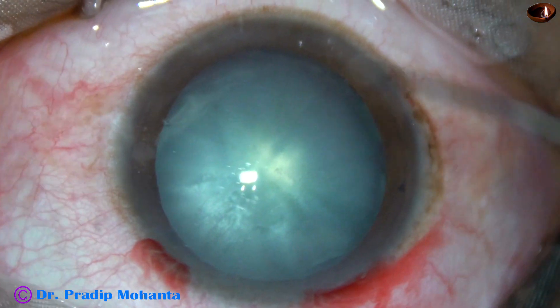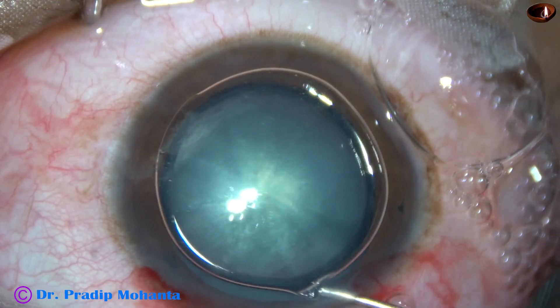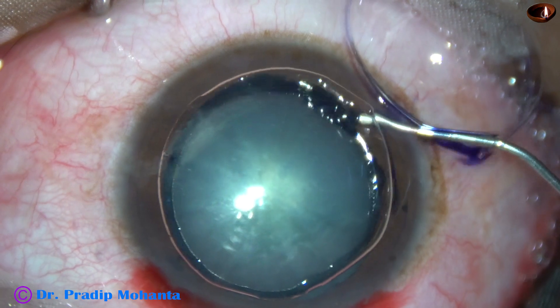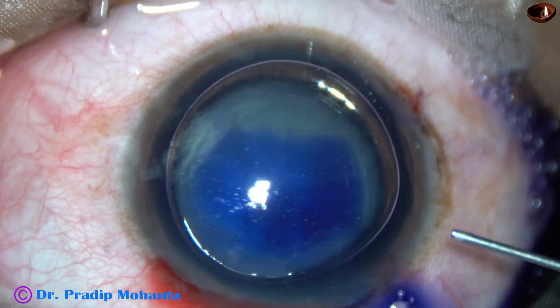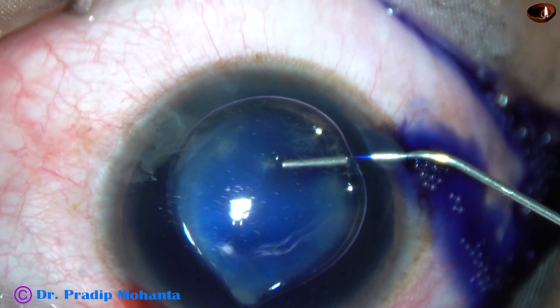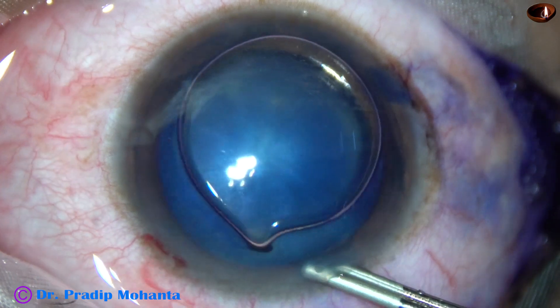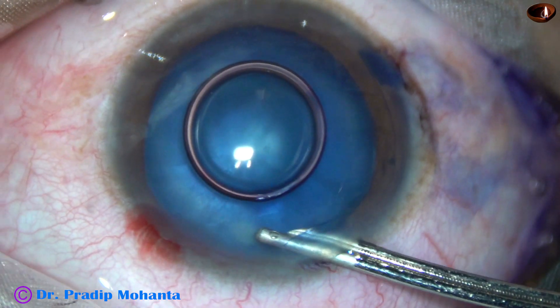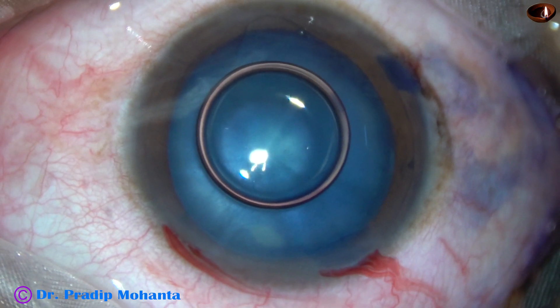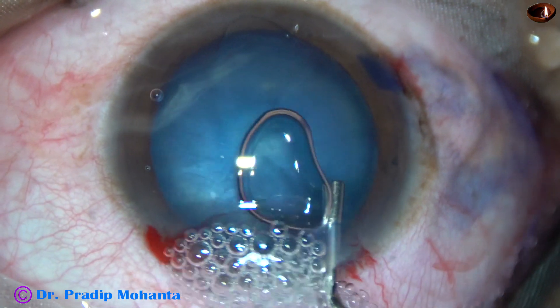And now an air bubble is injected to fill the anterior chamber. Beneath this air bubble, trypan blue dye is applied over the anterior capsule. When we apply the dye underneath an air bubble over a dry capsule, the staining is immediate. Now the dye is washed out with BSS. And then 2% hydroxypropyl methylcellulose is used to fill the anterior chamber.